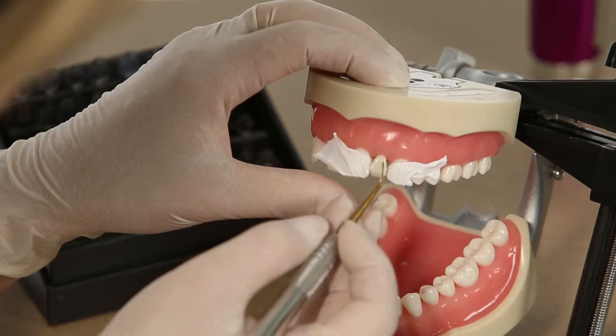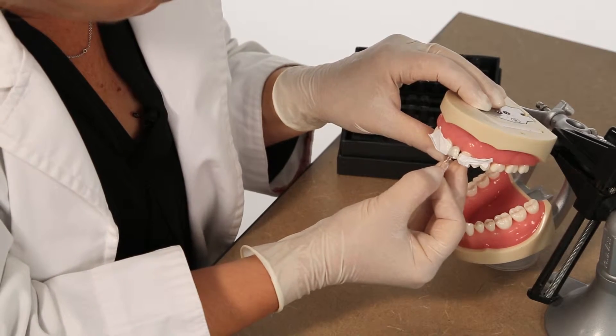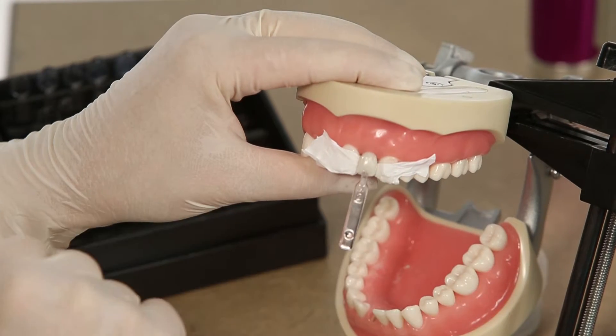Apply composite to the tooth and fill in the gap. Once the desired shape is achieved, press the Uveneer template onto the composite.